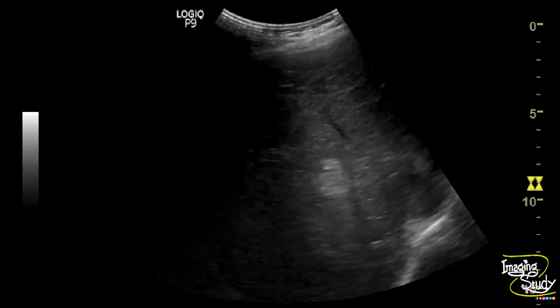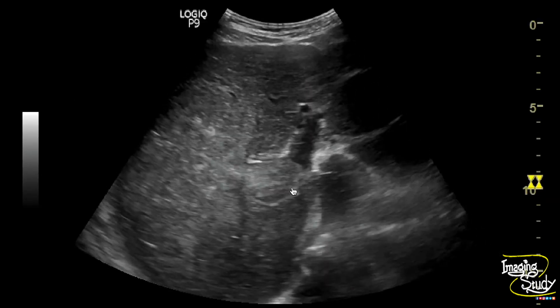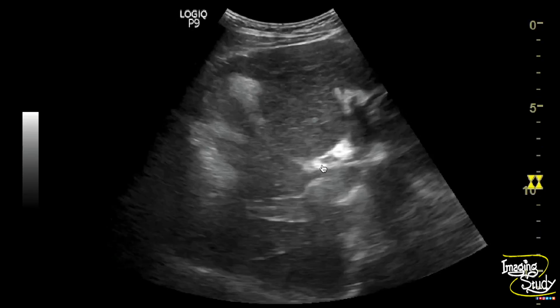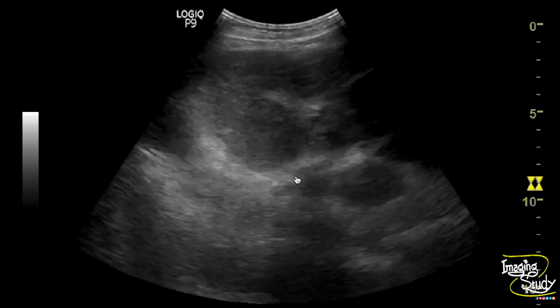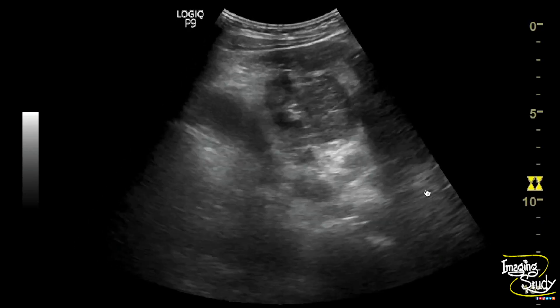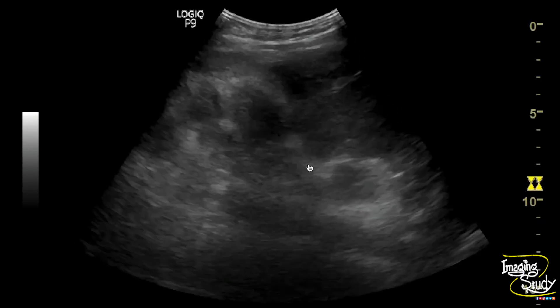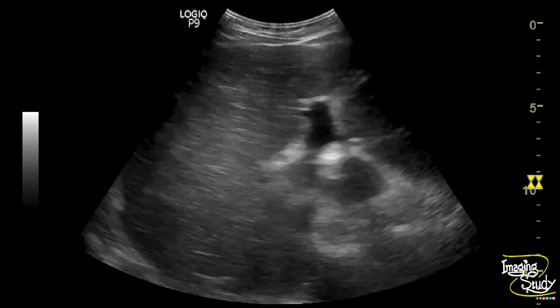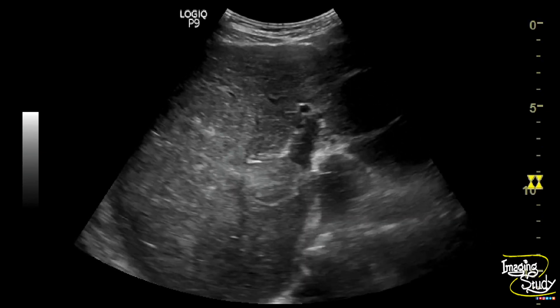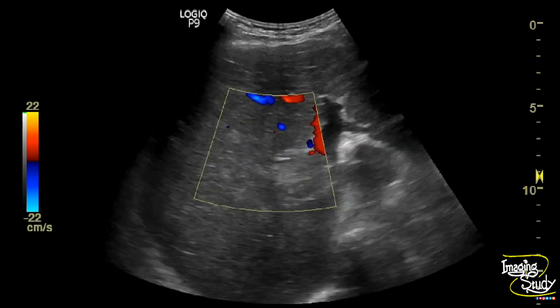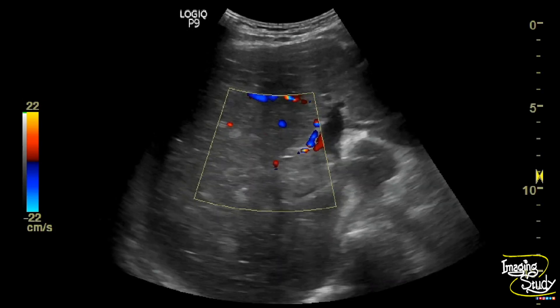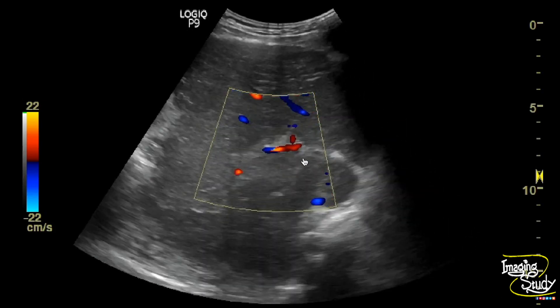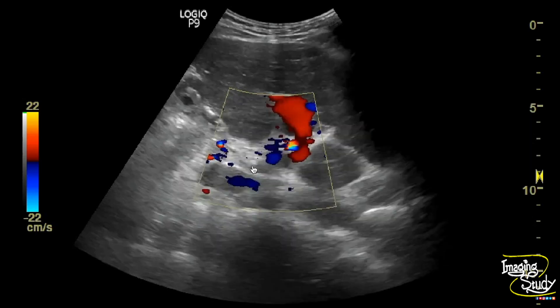Now let's look at the portal vein. Here you can see the main portal vein showing an irregular hyperechogenic structure within the lumen. The right portal vein shows a clear lumen. When we apply color Doppler, you can see there is flow within the right portal vein but the main portal vein is occluded.